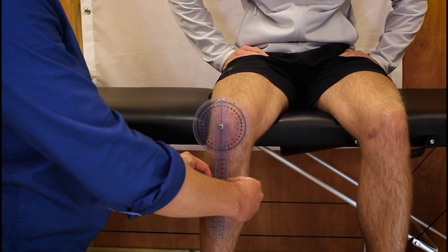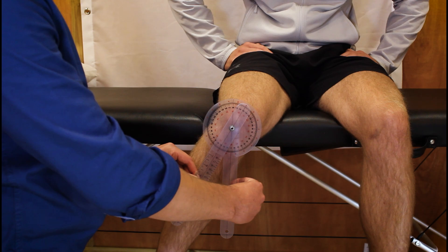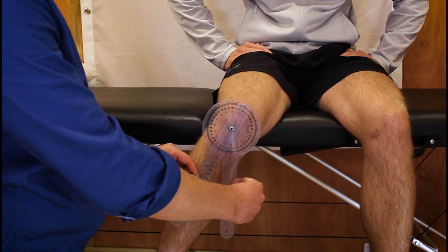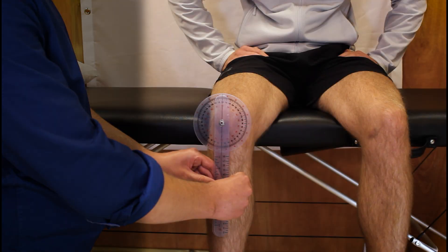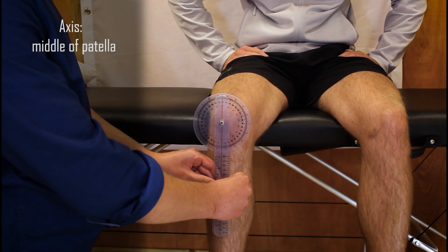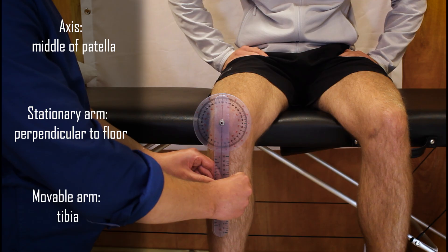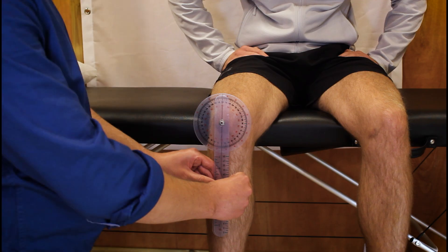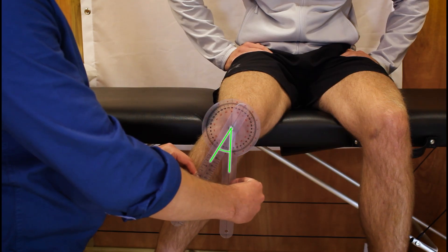To measure hip internal rotation, the patient is positioned in sitting with the hip and knee at 90 degrees. The axis of the goniometer is placed over the midpoint of the patella, with the stationary arm perpendicular to the floor and the movable arm parallel to the tibia. Ask the patient to twist their hip so that their foot pulls outwards.